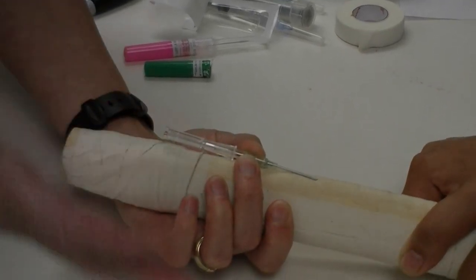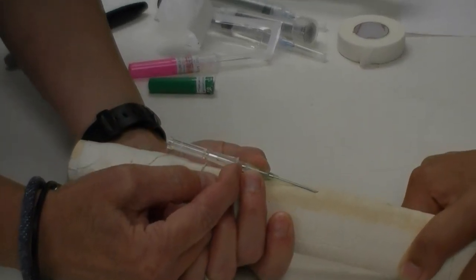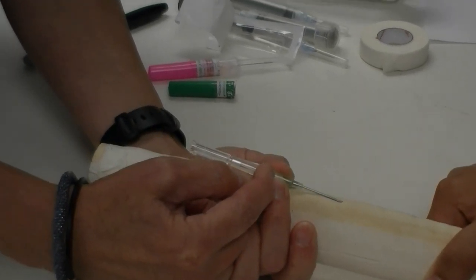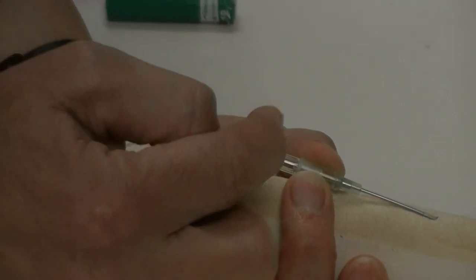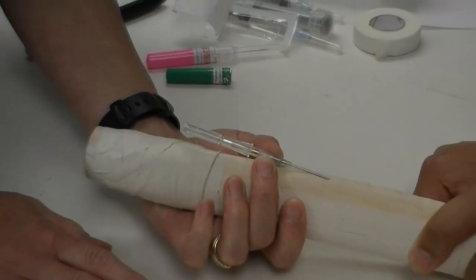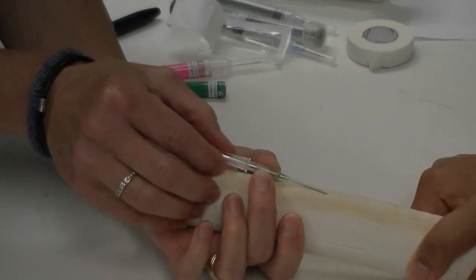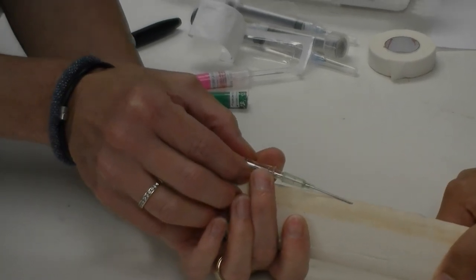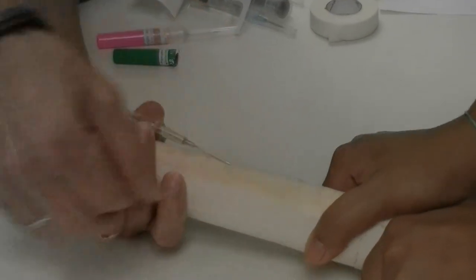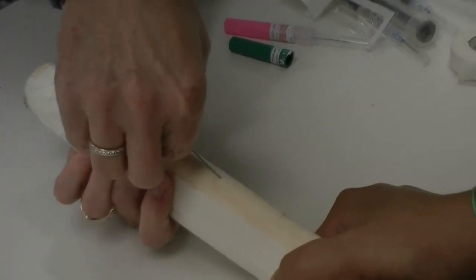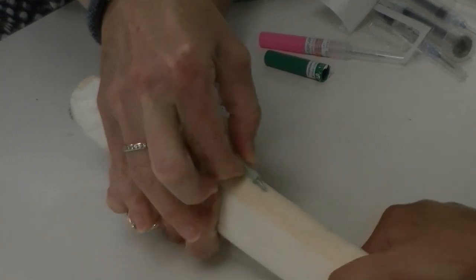Now I have to reposition my hand. What we are not doing is what we like to call the flicking method, where we flick the catheter forward into the vein, because my fingers are not sterile and I'm technically contaminating the end of this catheter. What I'll do instead is reposition my hand, hold the stylet, and then take my free hand and advance the catheter forward off the stylet. This goes all the way to the hub.